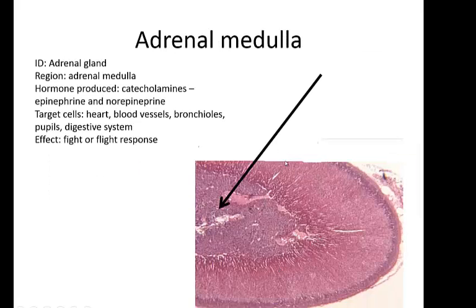I feel like we haven't done all those zones, but I guess we have. For the adrenal medulla, it's this middle region in here, all this middle region, and these big areas right here are just big veins. This middle region is made of all chromaffin cells. This is the adrenal medulla. If you want to look up how to spell that, do, but these are all chromaffin cells.